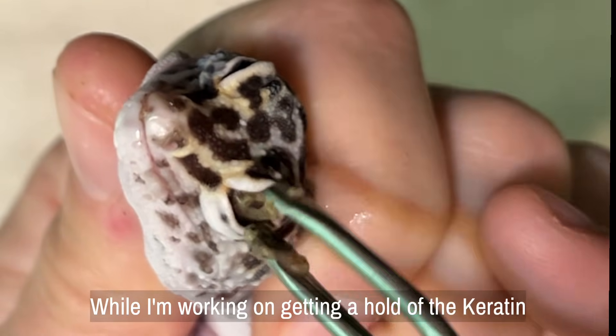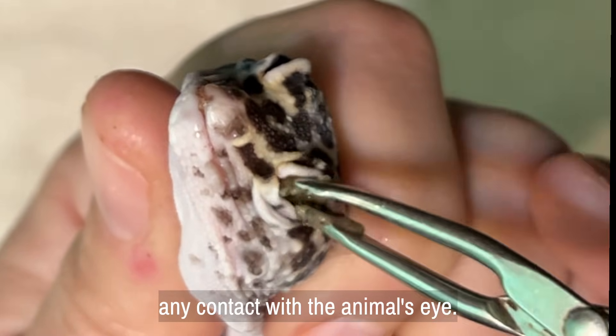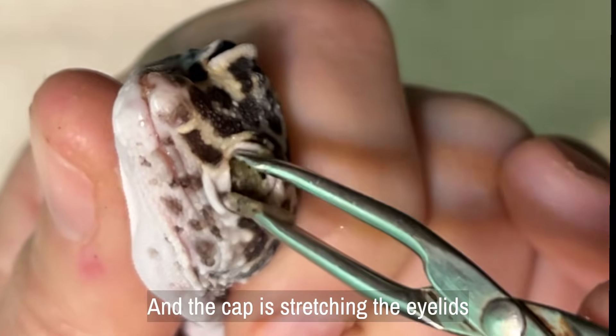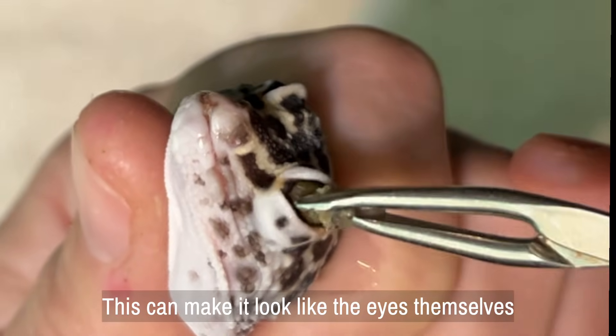While I'm working on getting a hold of the keratin cap, it's important to remember that I'm not in any contact with the animal's eye. The eye is tucked back behind this cap, and the cap is stretching the eyelids outward. This can make it look like the eyes themselves are swollen.